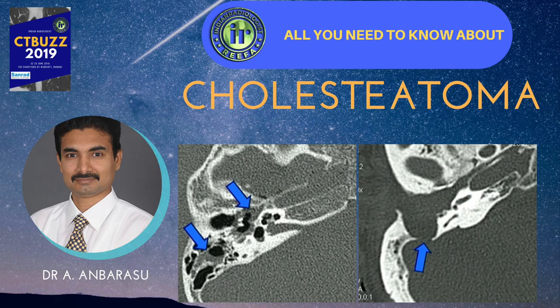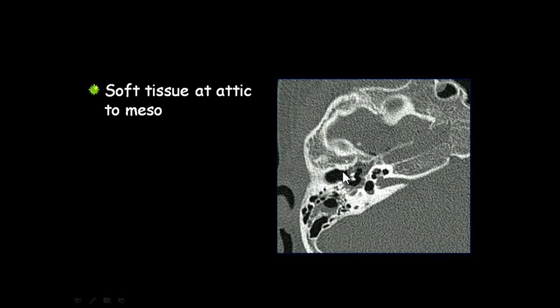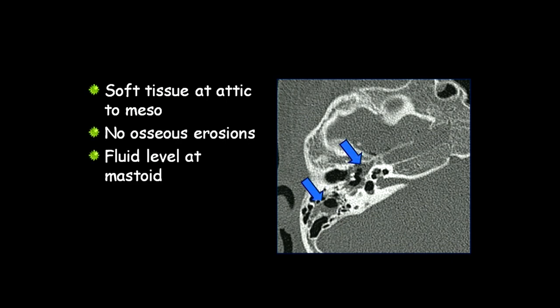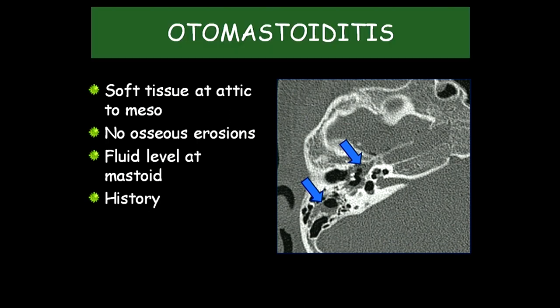You see soft tissue at the attic or mesotympanum. The ossicular chain seems to be intact, but you see an air cell which looks like a coalescent cell, and there is a fluid level. There is no osseous erosion in this particular patient. There is a fluid level at the mastoid, a history of otorrhea, and the patient has ear pain — this is otomastoiditis.